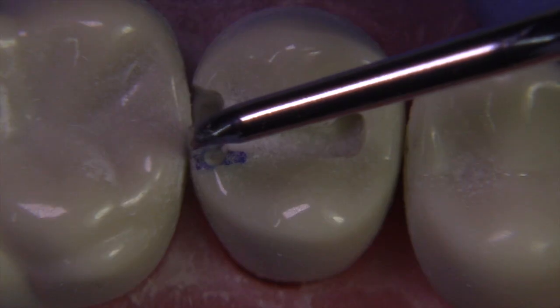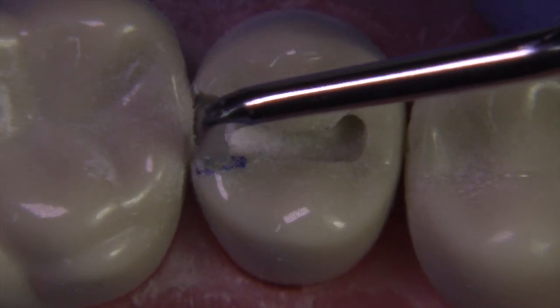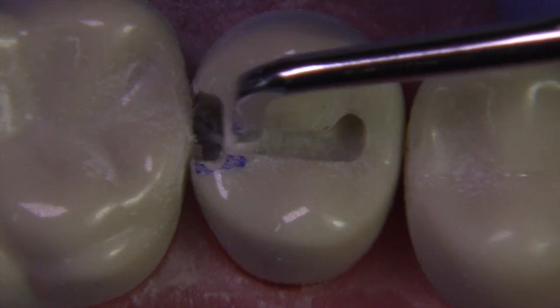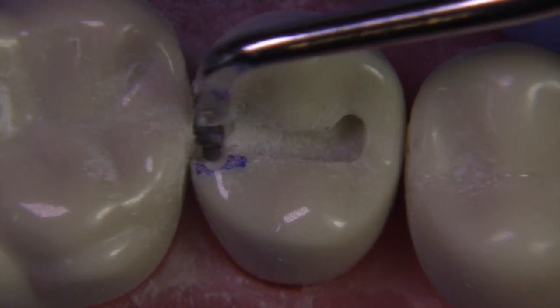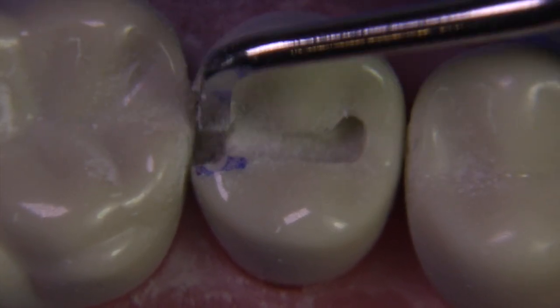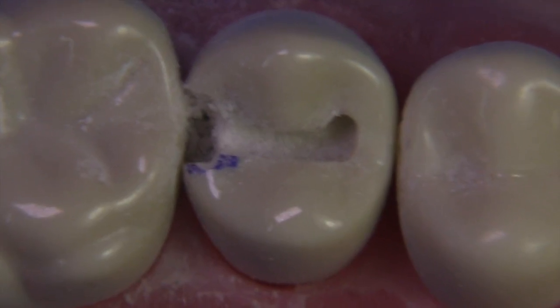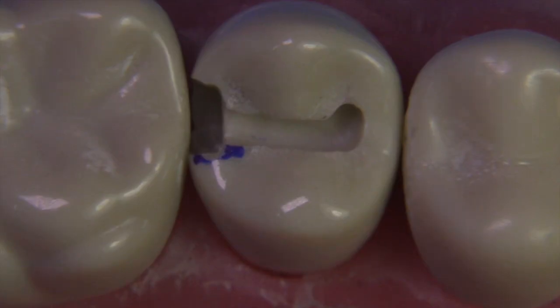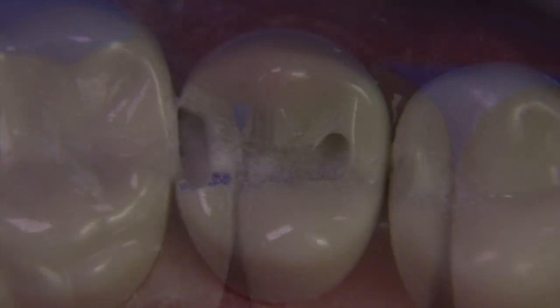Always maintain the correct exit angle — 90 degrees — while you chop, so you're not creating a flare or an extremely undermined area to deal with later. If you have the right exit angle while extending and get the right amount of clearance, you don't have to correct anything. For amalgam, we need more clearance — we need access for condensing at those areas. It's a meticulous and tedious process, but you just have to work your way through it until you've got the right amount of clearance.